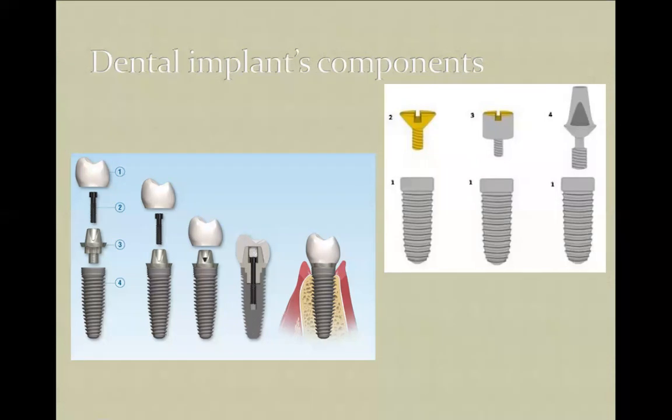We have a lot of types of dental implants. There might be screw type endosseous implants, subperiosteal implants, and so-called plate type implants.